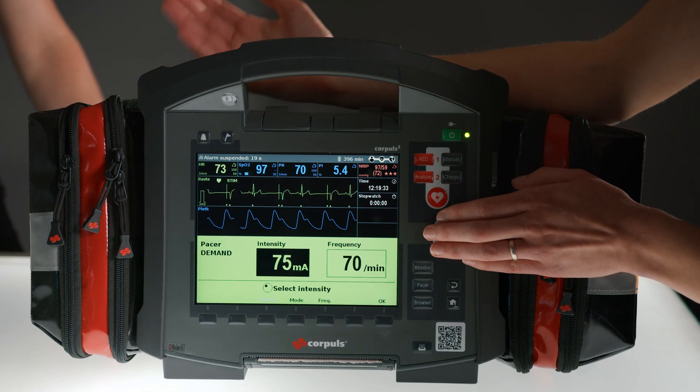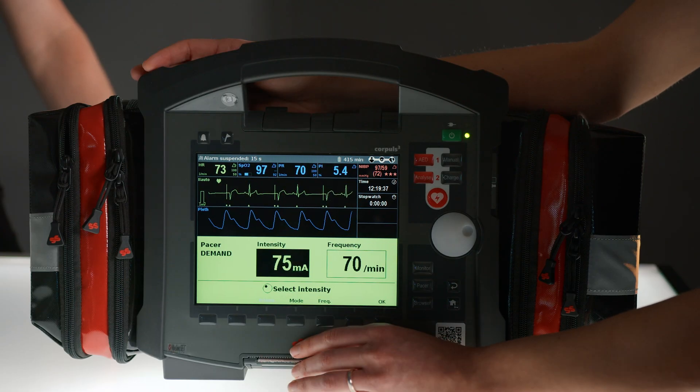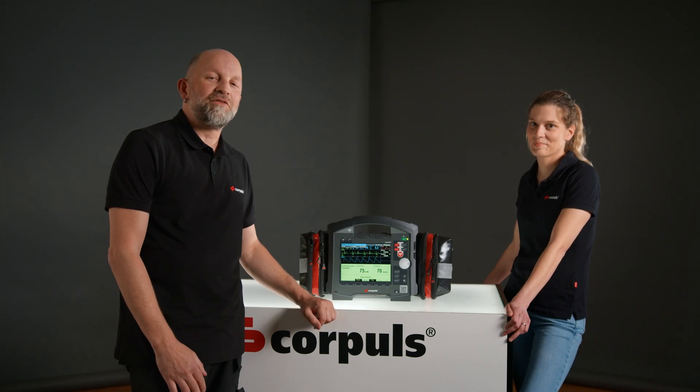You can also add a safety buffer on top of this. I would now choose 10 mA here. This is also regionally variable. We are now in an ongoing PACER therapy.